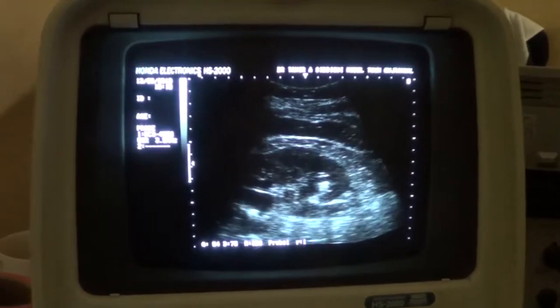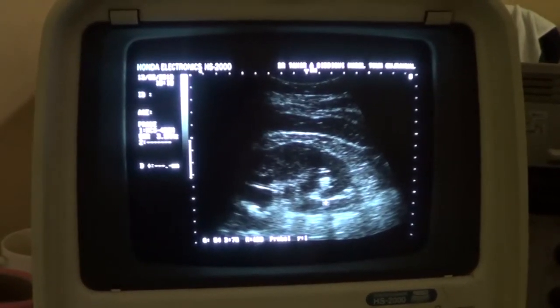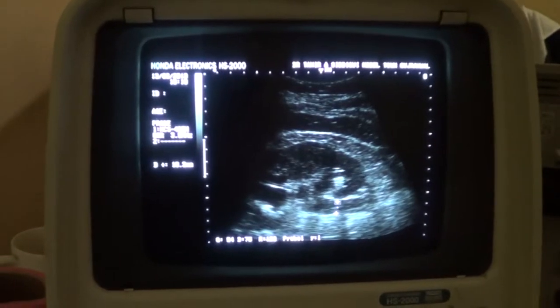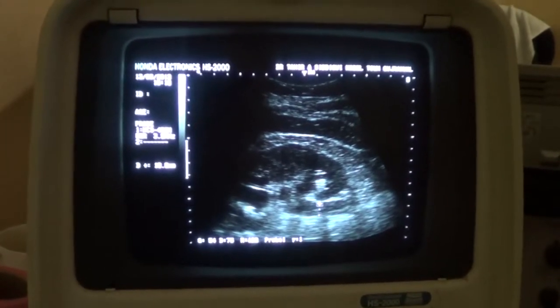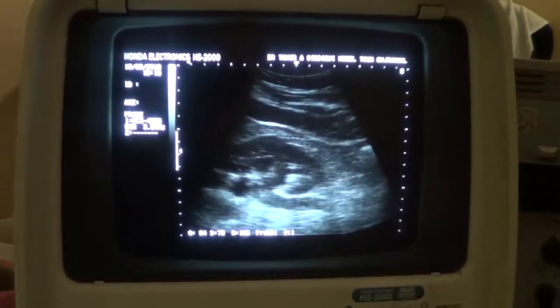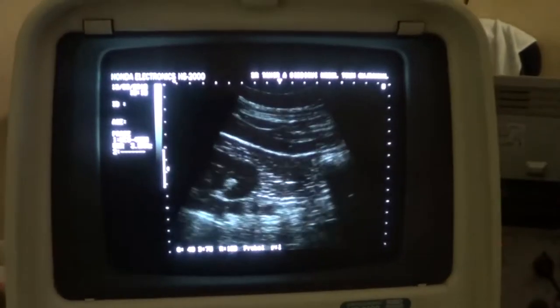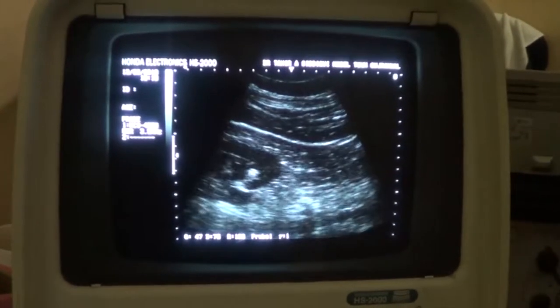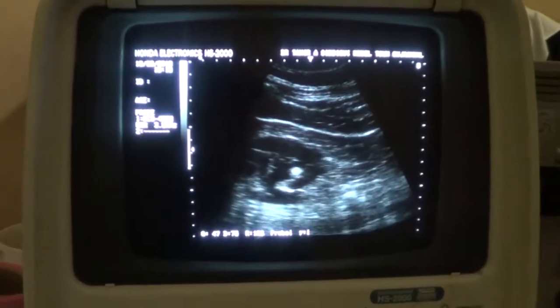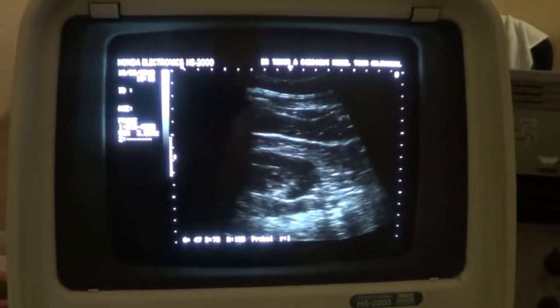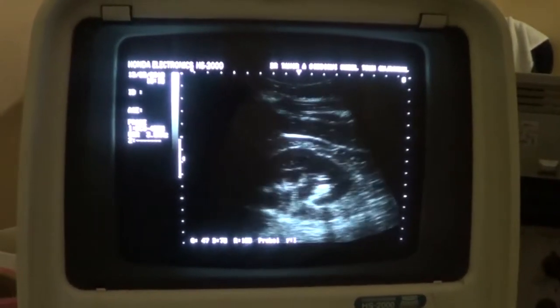The proximal ureter is also dilated. This tube-like structure is the proximal ureter, measuring approximately 10 millimeters. We know that the normal should not exceed more than 7 millimeters, so the proximal ureter is dilated. When I trace this proximal ureter, here I can see a calculus in the proximal ureter, within the lumen of the dilated proximal ureter.